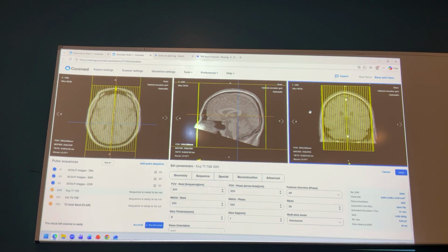Okay, first before we move on to this part. So, Vivian, let's say this is the brain. If I want to do the sagittal cut, how am I cutting? This way? Oh, sagittal. Yes, this way. Okay, so like this, and then the cuts are going to go left to right or right to left. Either one is fine. Just as long as you know that sagittal cut is like this, okay?